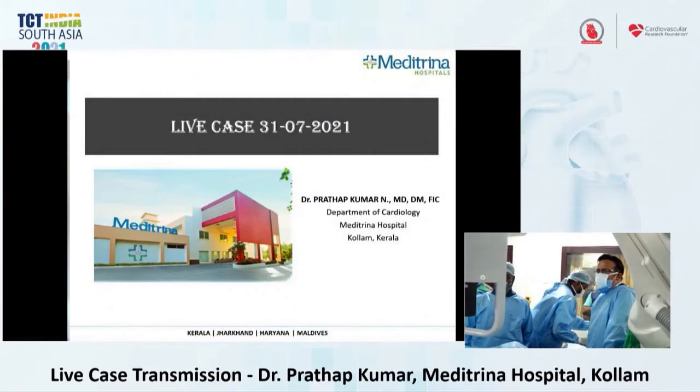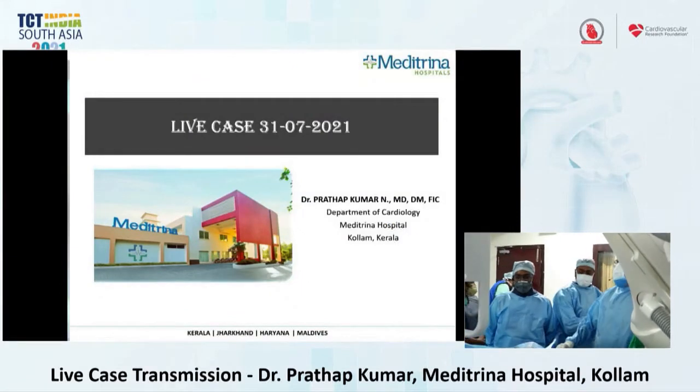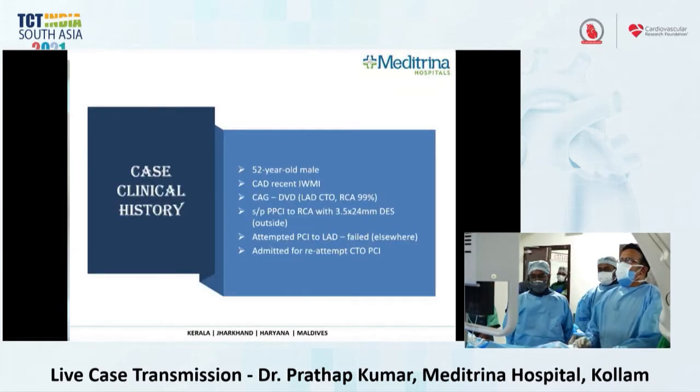Good evening to all. Our patient is a 52-year-old male who had a recent inferior MI.